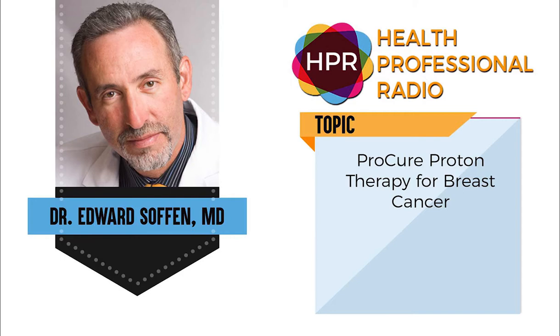And what's fascinating about protons is that they stop. So when they come to a stop in the target, they give off all of their energy and destroy the tumor cell. So it's different from conventional radiation because it doesn't irradiate as much of the normal tissue around the target. Particularly in breast cancer, it spares lung and it spares heart and it can spare the nerves under the arm.